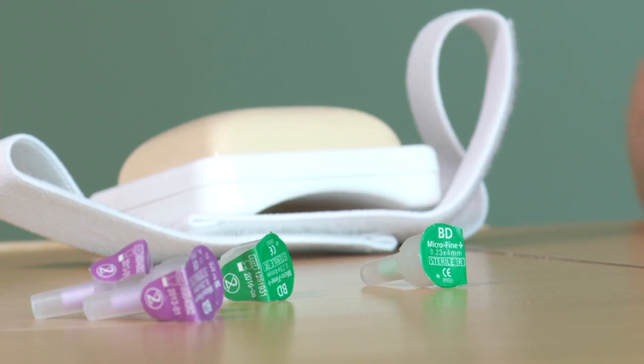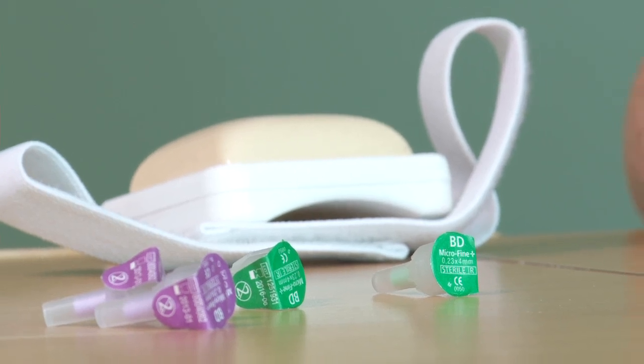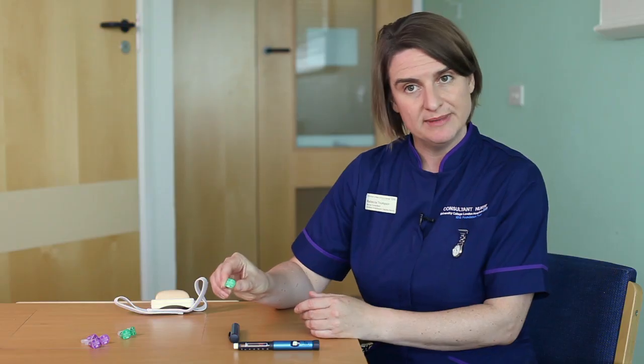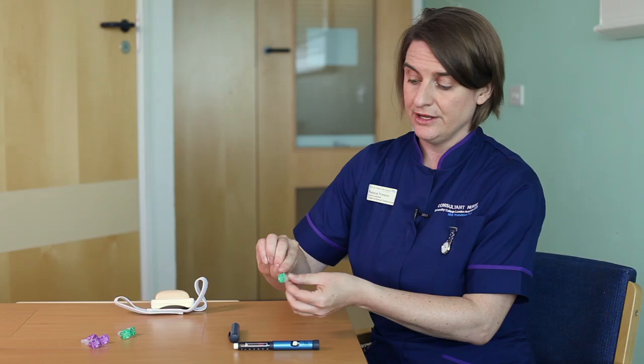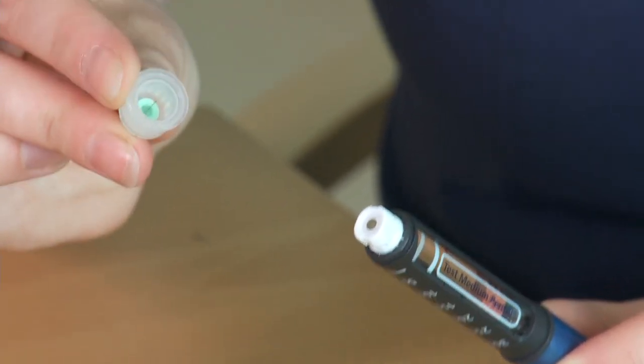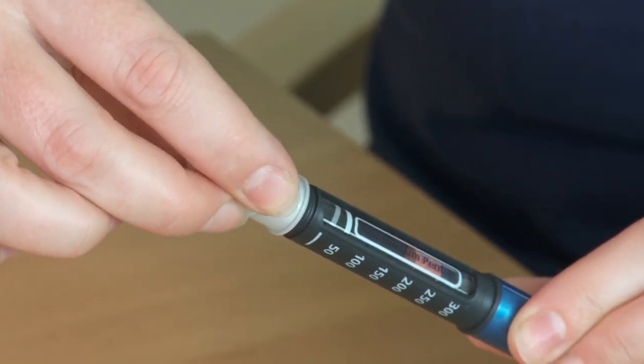Before proceeding with the injection you need to make sure your hands are clean, so wash your hands before you start. Now you've washed your hands, you're going to put a new needle on the pen device. There are different size needles and the needle lengths that you use will depend on your child — that needs to be a conversation with your healthcare team. This needle is a four millimetre needle, which I'm going to demonstrate. You peel off the end and then push and twist it onto the end of the pen device.